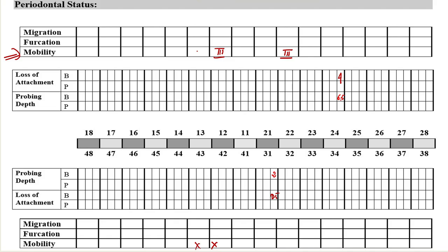Coming back to our periodontal charting: the furcation areas are not involved in case of health, whereas in this particular case it was a grade 3 furcation defect.